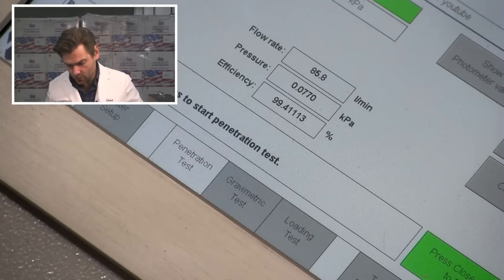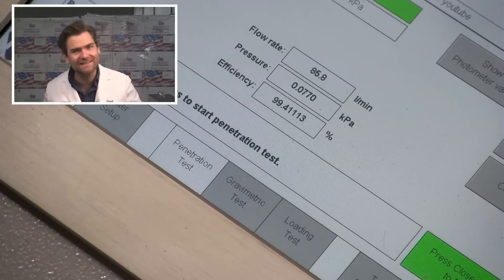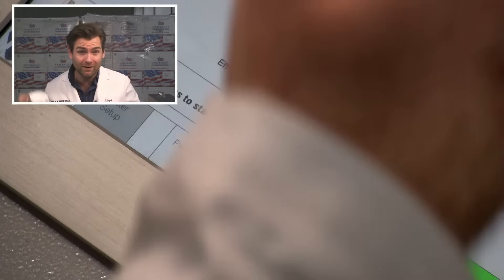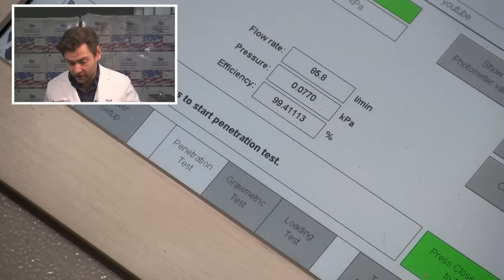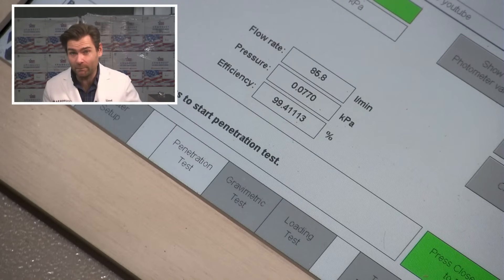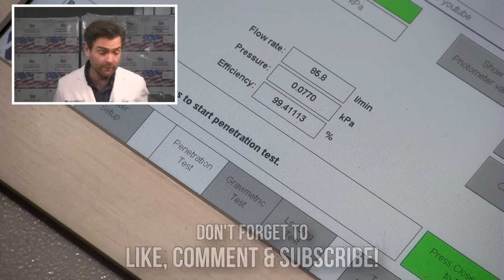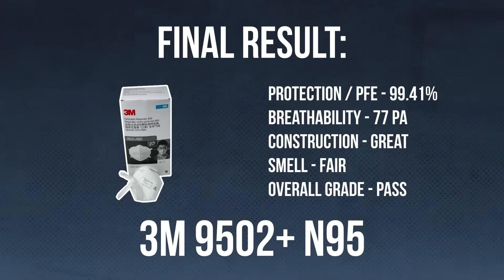Look at that. Wow. 77 Pascals. This is a Chinese-made mask. 3M has their own melt-blown facility in China, I've been told. And look at that — that is great. This is probably the best melt blown I've ever seen. It's probably the most breathable KN95 I've ever seen. 99.41. 3M makes a good mask.